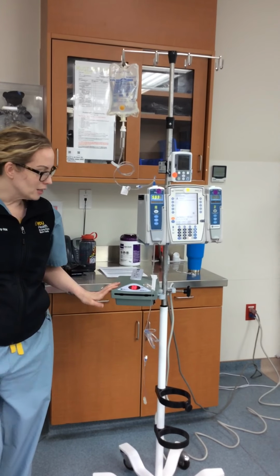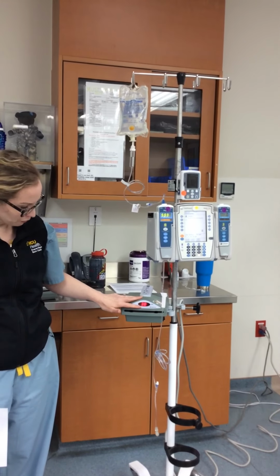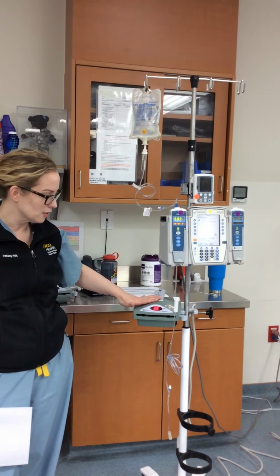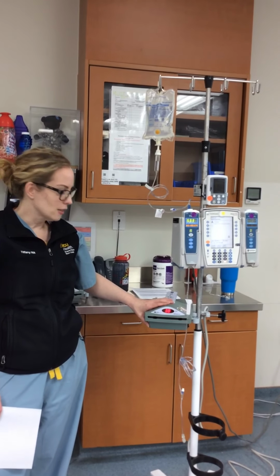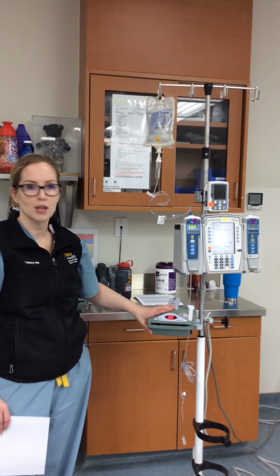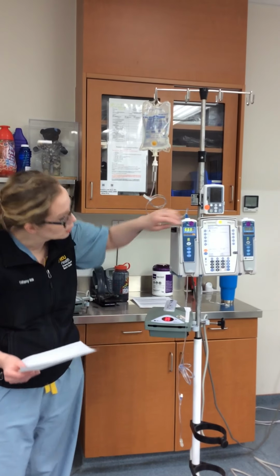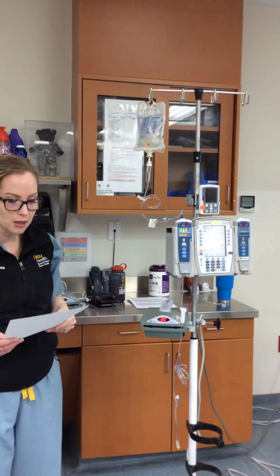It is automatically set to 41 degrees Celsius, so once you turn it on, you'll see the temperature on the front, but you cannot regulate anything about that. The machine itself is going to get itself to 41 degrees and maintain it. It does self-check internally 4 times a second to make sure that the temperature is correct. I think that is the basics of it. And we'll go ahead and go through a quick demo so you can see how it's done.